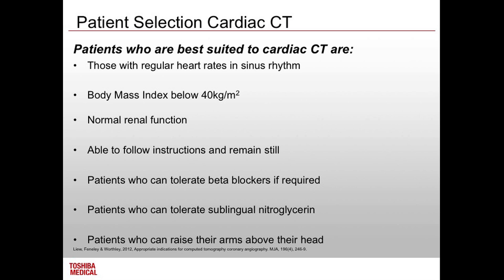One of the questions I had when I was an application specialist, to a cardiologist, was: if we're giving them nitroglycerin and we scan, then their vessels are bigger. So if they do have a soft plaque and you're looking at which stent size to put in, you've just made their vessel look bigger. And I thought, surely that's wrong. And he said, no, because we always oversize our stents. So we'll actually give a direct injection of nitroglycerin into that blood vessel and then do our measurements. So it's important, if you can, to have that.